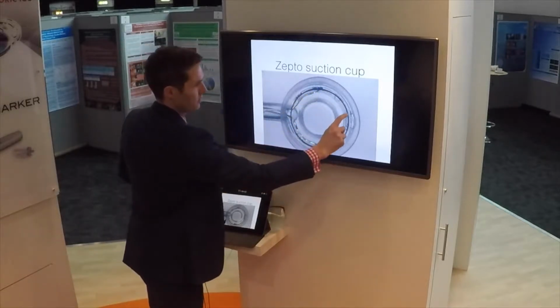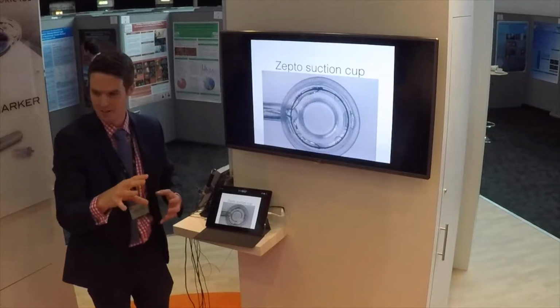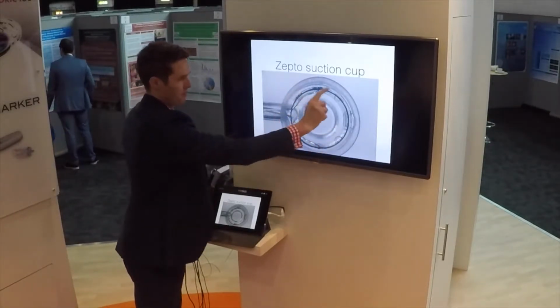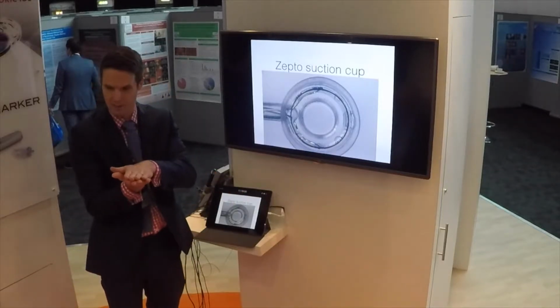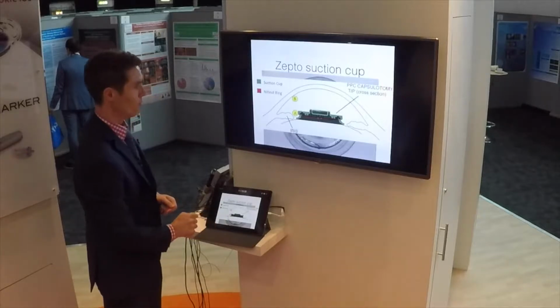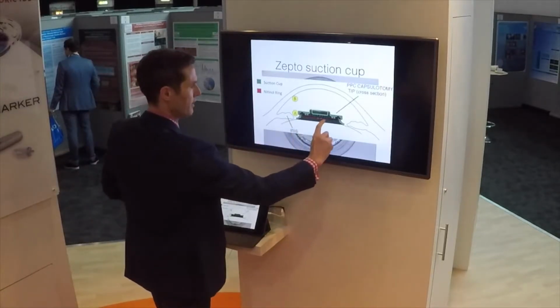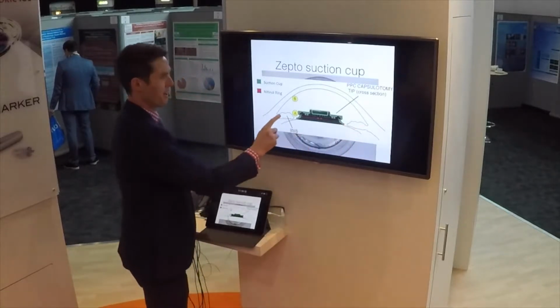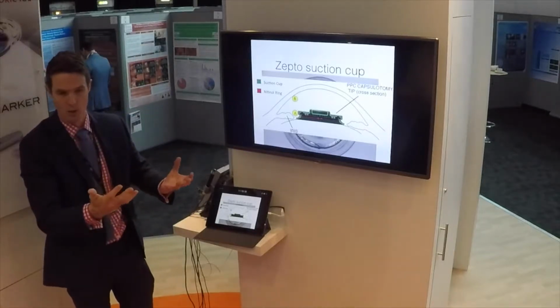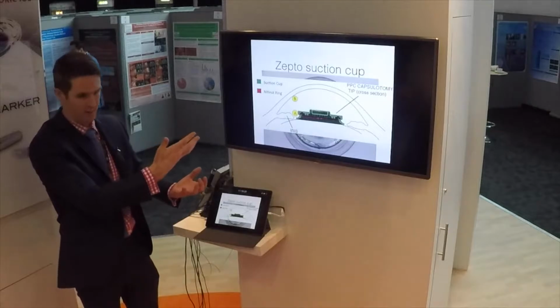It will create the opening 360 degrees. There are no tags and tears like you get with femtosecond laser. What you're left with is a circle of anterior capsule on the underside of the suction cup, which you can then see physically. So this is how it works. This is the anterior capsule. This is the iris here and here. You go in through your normal wound. So my surgery is a 2.2 and it easily fits through that, and we'll just show that in a second.